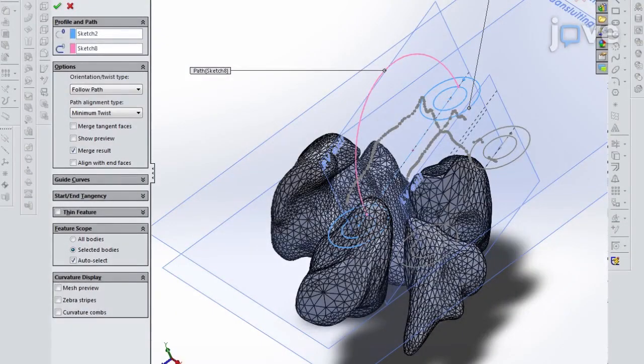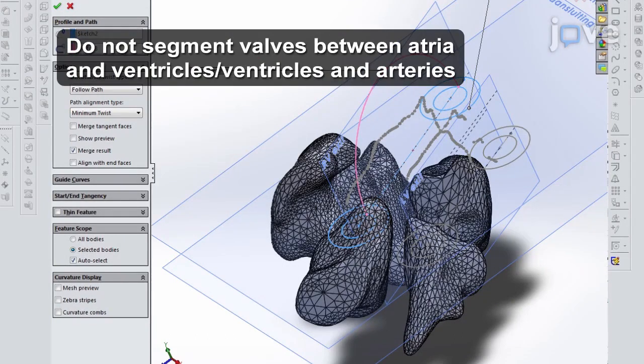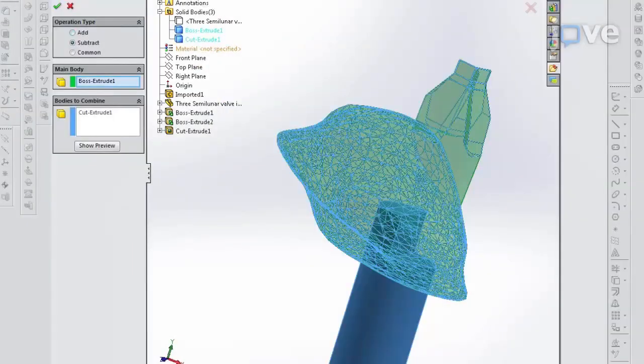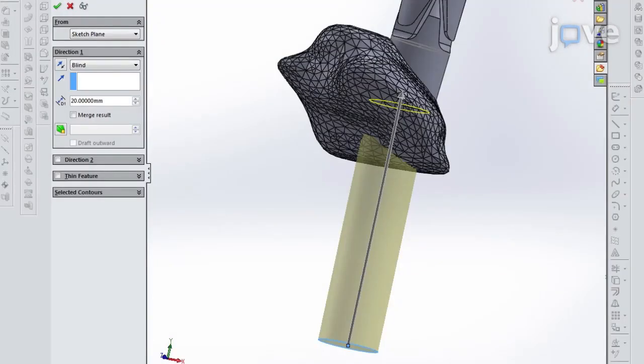Separately segment the two atria and the two ventricles in the same manner and use the Calculate 3D tool to render the muscle and chambers into separate 3D representations. Then use the Stereolithography Plus tool to export the segments as 5 stereolithography files using the optimal resolution for each file.